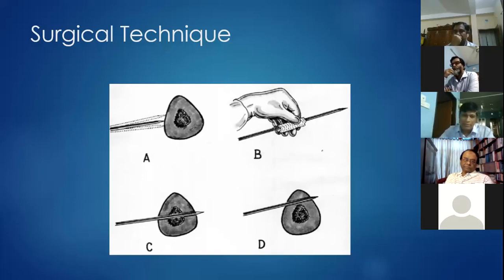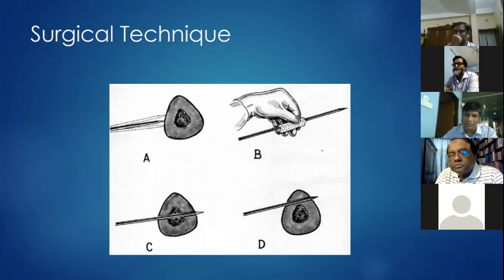When we reach the cortical bone, then start drilling with low speed drilling. To avoid bending, to maintain a straight trajectory, and to decrease the temperature or heat produced during drilling, we can use a wet sponge that can be gripped at the entry point. We wet the sponge with alcohol, or maybe chlorhexidine also can be used.